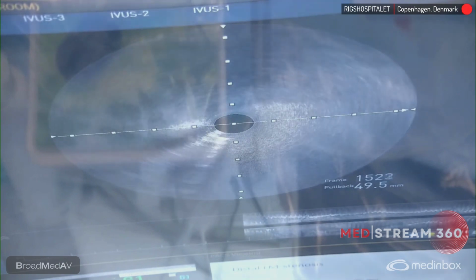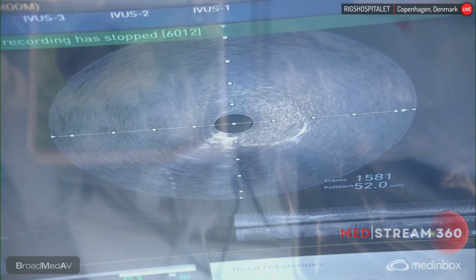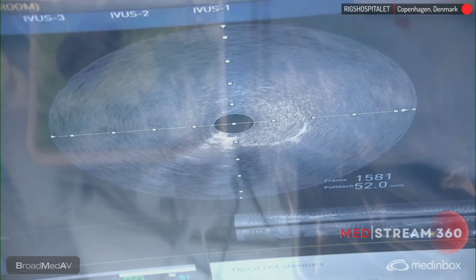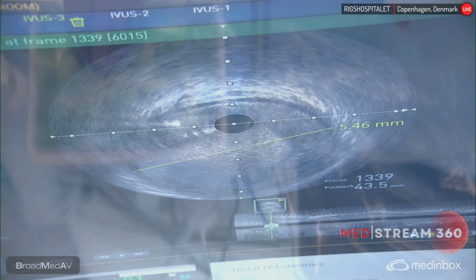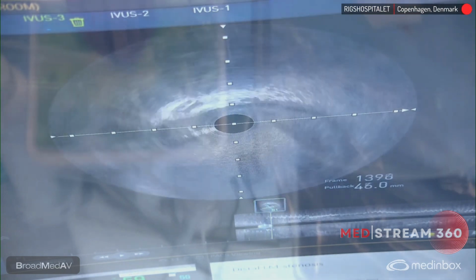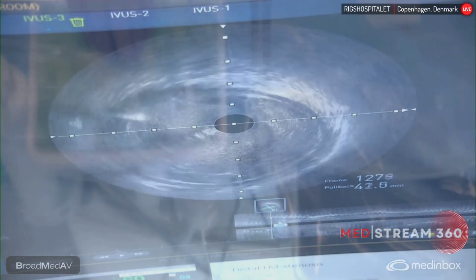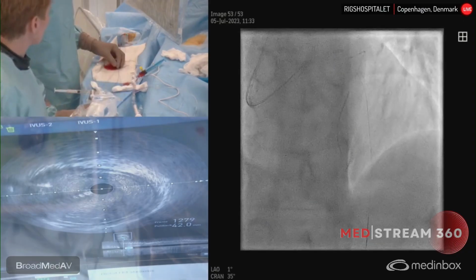We know that it's a soft plaque, so we can just go ahead and stent, but we want to see the ostium of the circ, even though it looks perfectly good on the angio. We just want to check with the IVUS, doing another measurement of the left main. If it's 5.5, yeah, I think you should go with 5.5 with the low pressure, because you have these 4 really big branches taken off here. Going into the circ. Yeah.